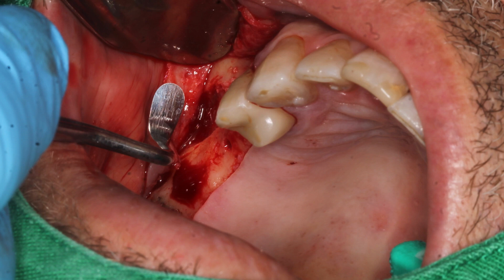All right. And then a series of curettes are going to be used to separate the membrane off the floor of the sinus, as well as the anterior border and the medial or the most midline area. I'm not going to spend a whole lot of time. All you need to know is that you pick the right instrument that works in your hand, has the right configurations, and of course, the key principle is to stay on the bone. Therefore, you do not tear the membrane unnecessarily.